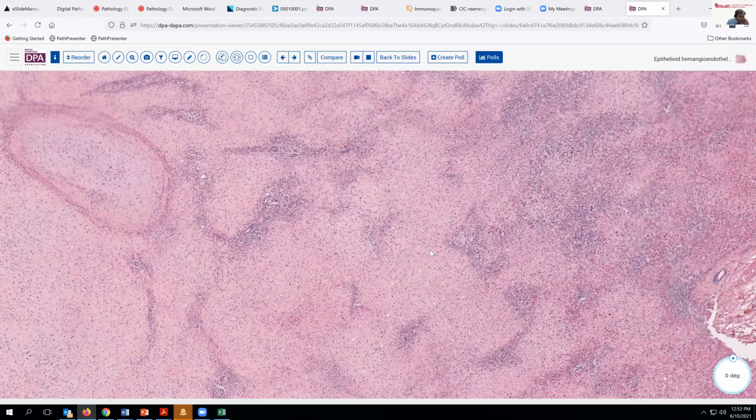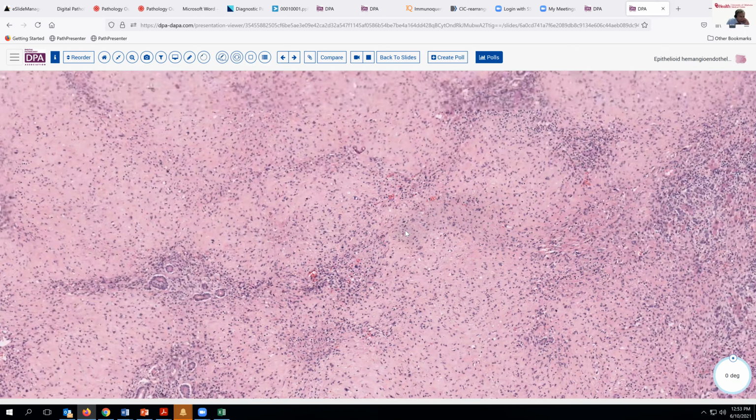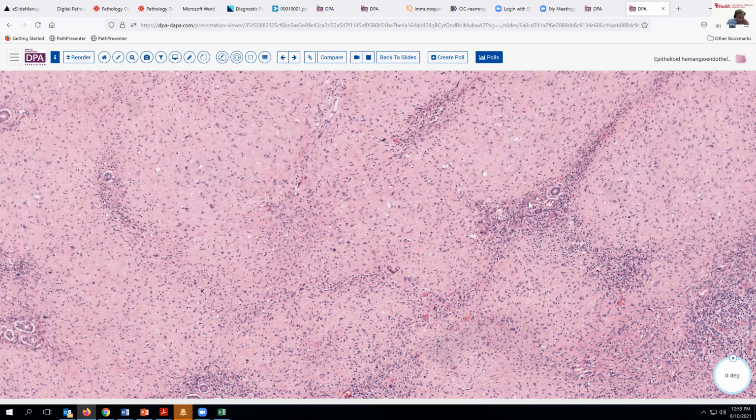I didn't have a needle biopsy case, but here you can see, gee, this looks just like a dense stromal scar. You're not seeing an endothelial component here. You're seeing a little bit of inflammation surrounding these areas of residual hepatocytic cells and bile ducts and so forth. Just seeing this sort of stromal appearance.